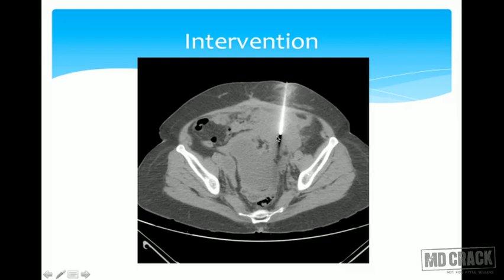So this image shows an ill-defined peritoneal mass over here, and what we've done is we've gone in with a needle, and we'll be taking a sample of this mass.